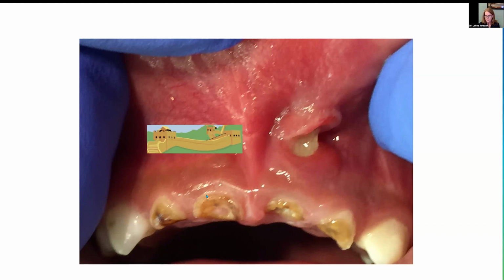So if you have a friend like this, who has this chronic infection and has this gnarly root up in the free gingiva in the vestibule up here, you're going to start with your intraosseous, but you're going to come up here and do a little infiltration around there, because that flap of tissue that mangled root is connected to is absolutely not anesthetized. And we don't want to hurt our little friends, like a little mean little monster sticking out of the garbage can there.